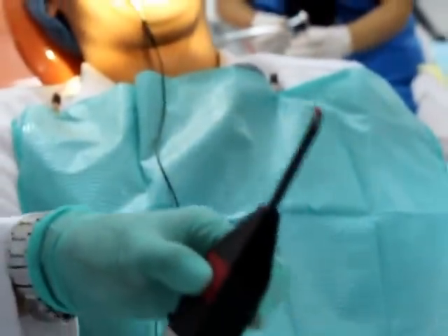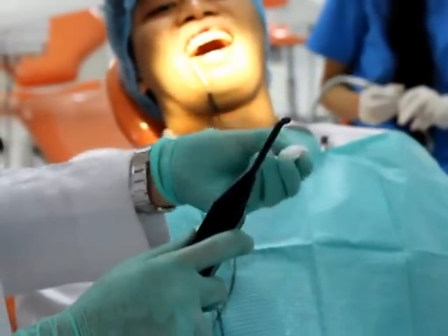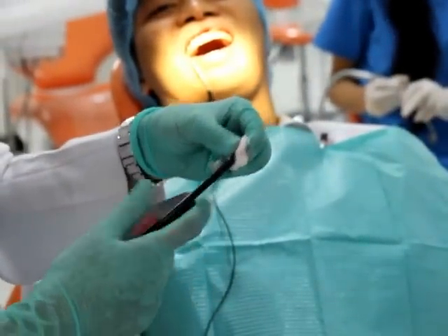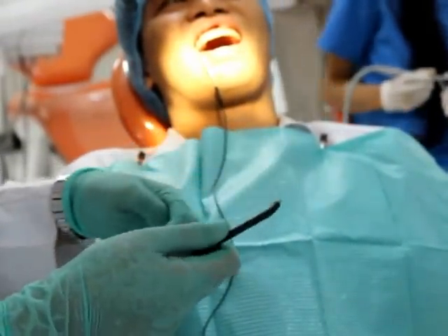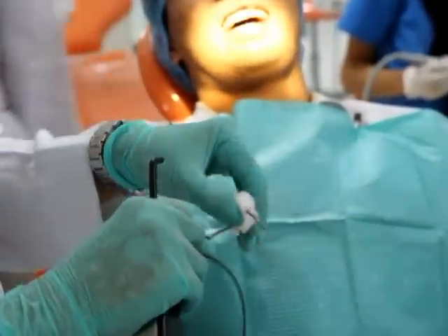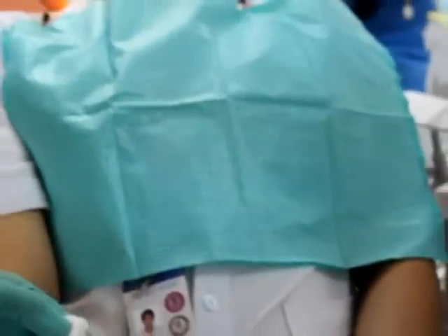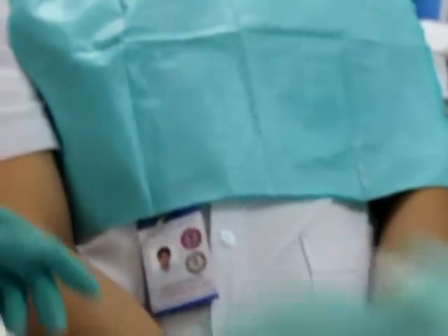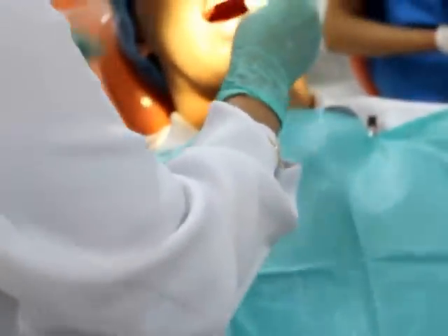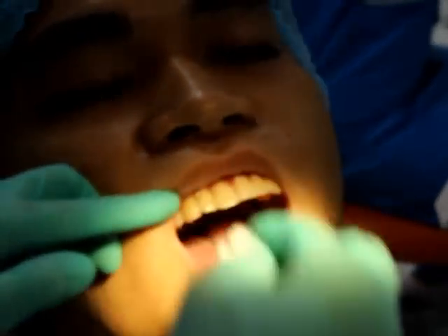So done. After you're done, you have to get alcohol. Clean it. Okay, clean. And then remove this. And then clean again. Ready for the next. Then clean also the surface.